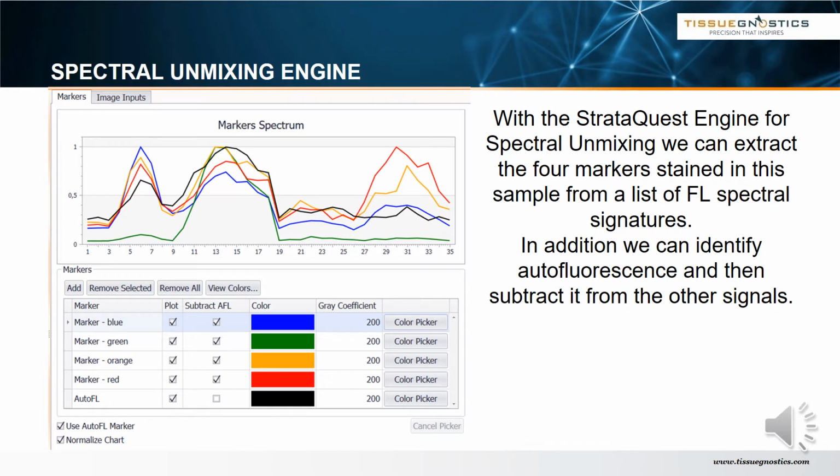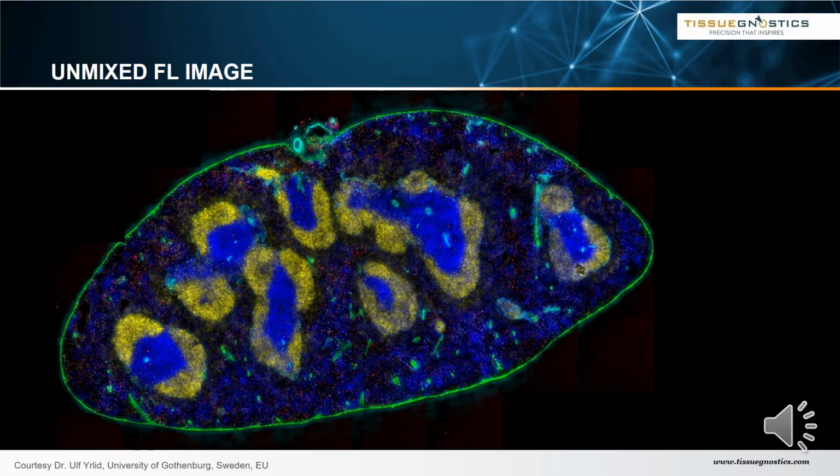Spectral unmixing. By using reference spectra of individual fluorochromes, it can be computed how much of the total emission comes from fluorochrome 1, 2, 3, 4, 5, 6, 7, 8, 9, 10. We compute how much from the total emission belongs to each fluorescent channel. And what we get is this: stunning images of fluorescent stained samples with multiple markers that allow to quantify multiple fluorochromes at the same time and determine co-expression patterns.